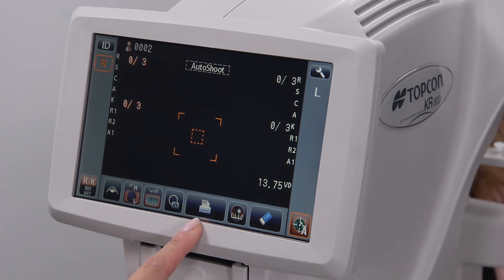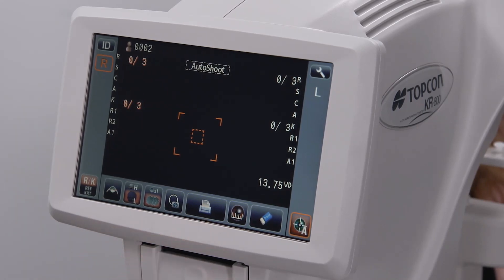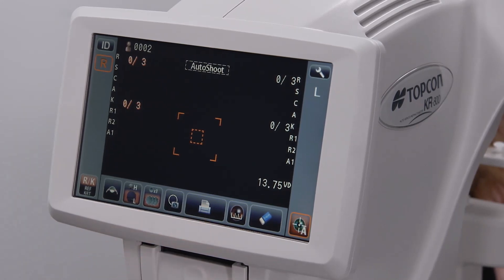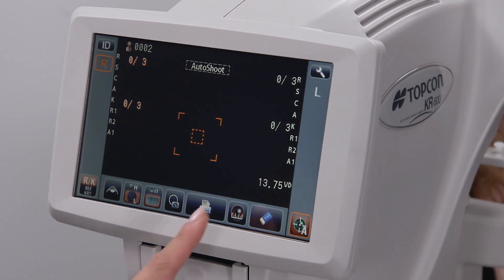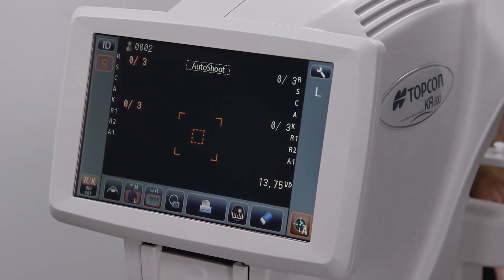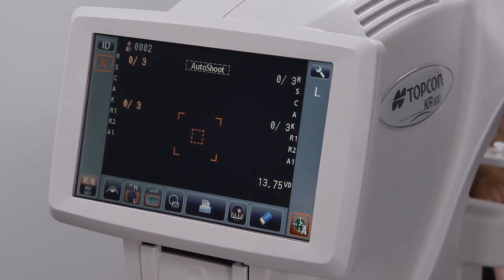The printer icon prints the information that was just acquired on the patient's eyes. The corneal diameter icon provides an image of the eye and an adjustable caliper tool to measure the diameter of the cornea from limbus to limbus.